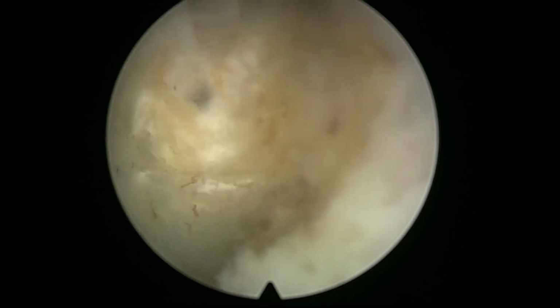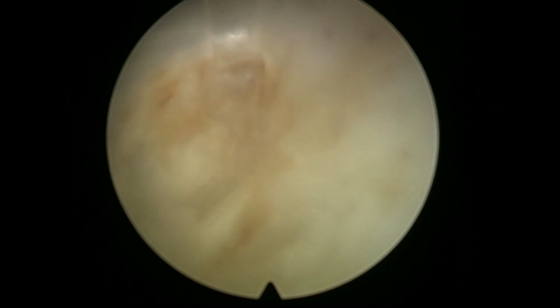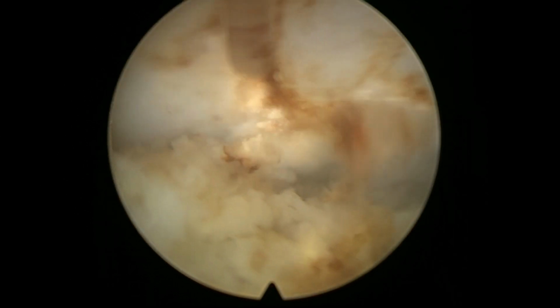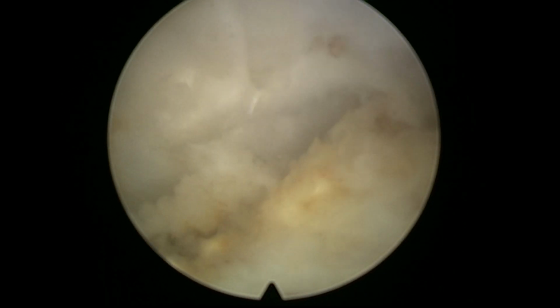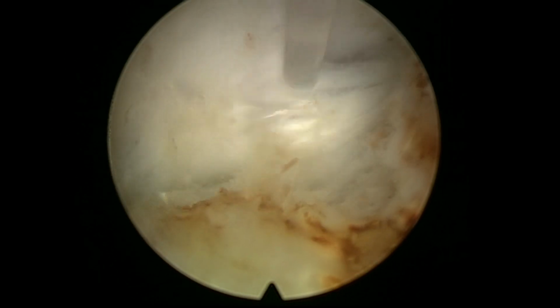Here you can see that the plane is not clearly distinguished. Also, I have to say, when you do en bloc, you get better ability to predict how the anatomy of the prostate is going to look like. When you do a lot of these cases, then more or less you know where things are, so you can intuitively find a plane which is probably not too far from the real plane, if there is any. That's the vertical fibers at 12 o'clock in the bladder neck, so I knew we could enter.